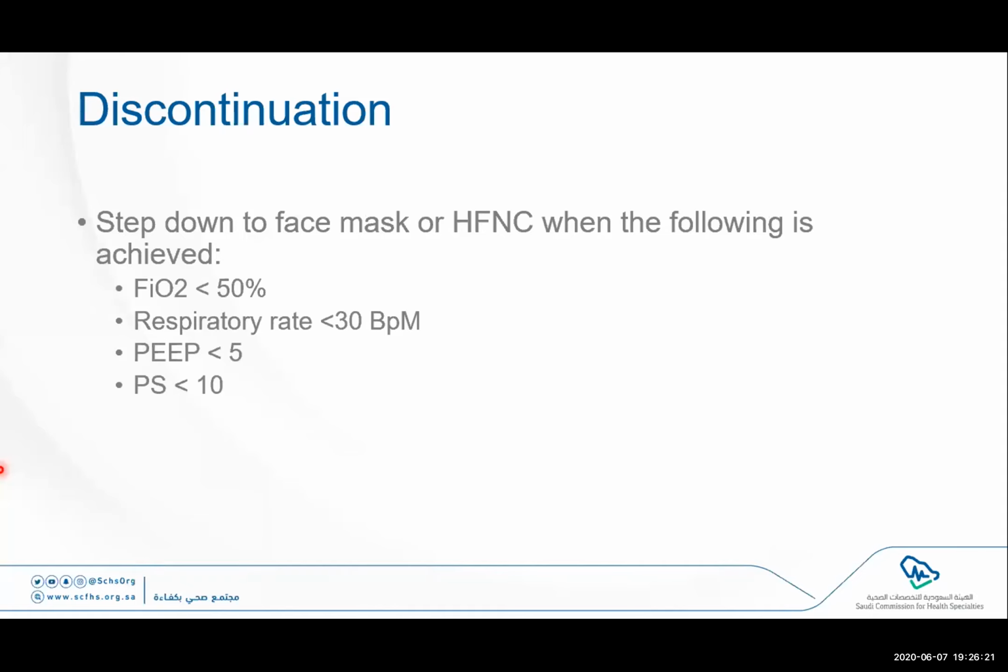Now, the discontinuation sometimes helps us for a few hours. Some patients require putting the helmet back again, depending on the situation. But most of the patients, once we start with the helmet, after a few hours and we do the discontinuation, don't really require going back to the helmet.